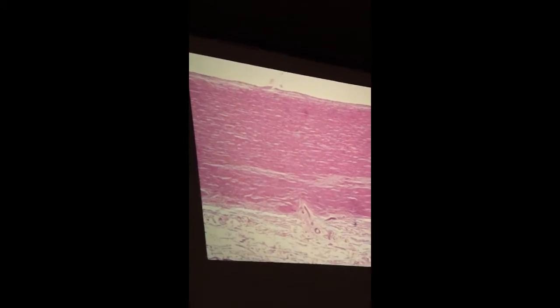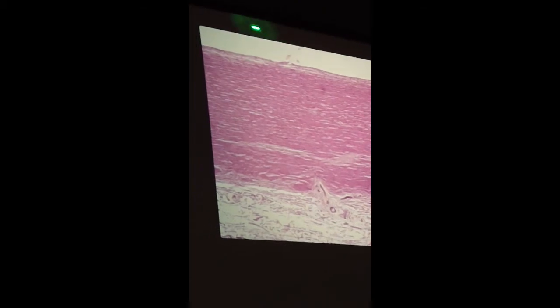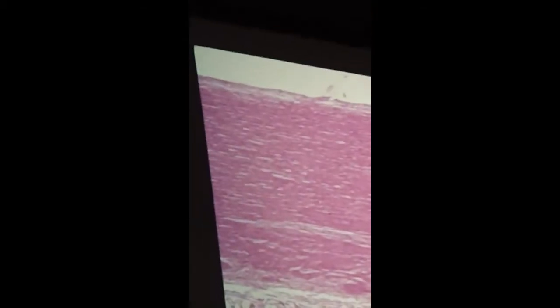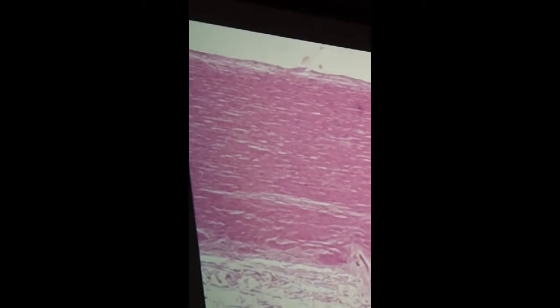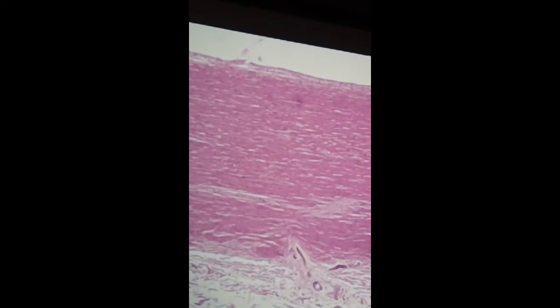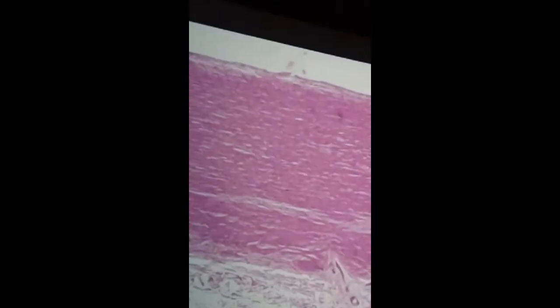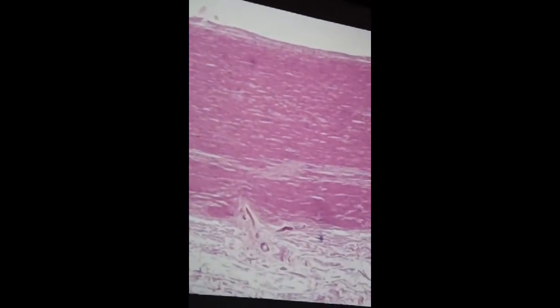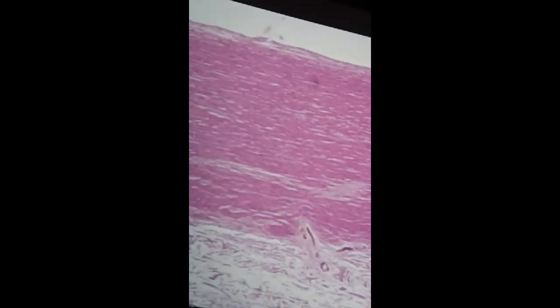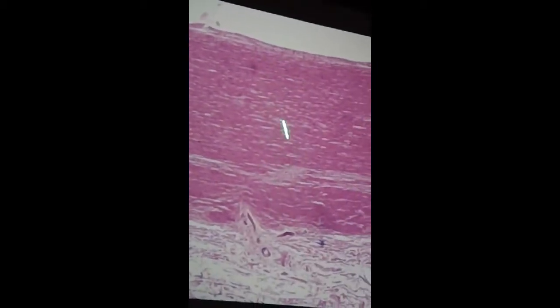Okay, here's a shot of the wall of the dorsal aorta. The lumen is up here. One way of making sure you're looking at the lumen is to identify the simple squamous cell that lines the luminal surfaces of a blood vessel. Endothelium. Now, you may not always be successful because sometimes that layer comes off very easily. But if you navigate along the luminal surface, chances are you're going to see that flattened nucleus of an endothelial cell. In 2 weeks, we'll be able to talk about the various regions of a blood vessel.